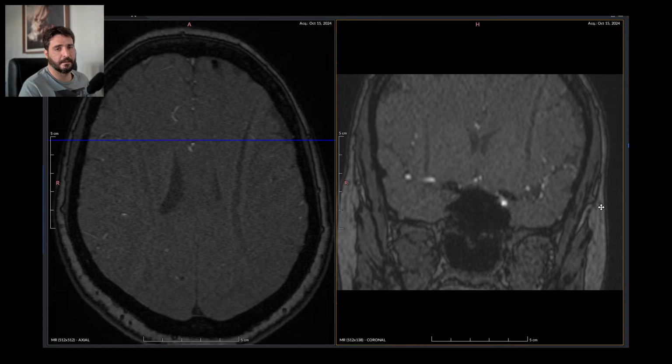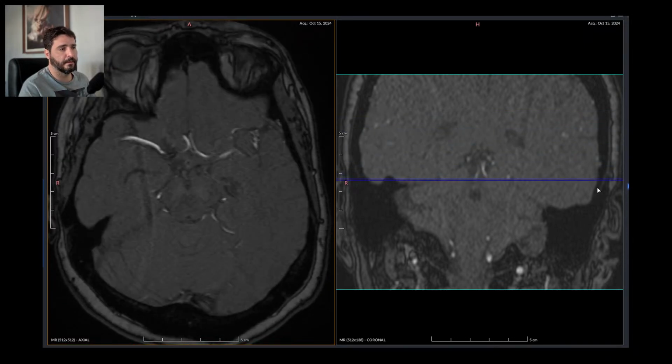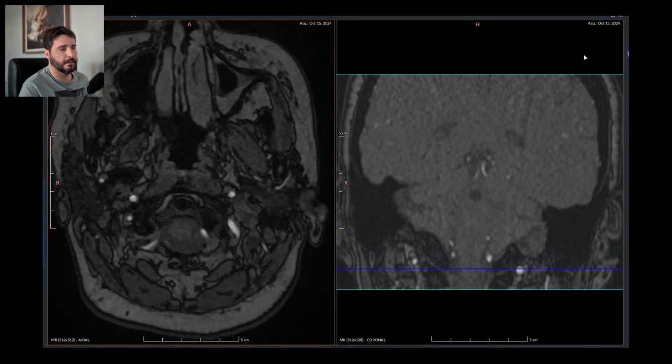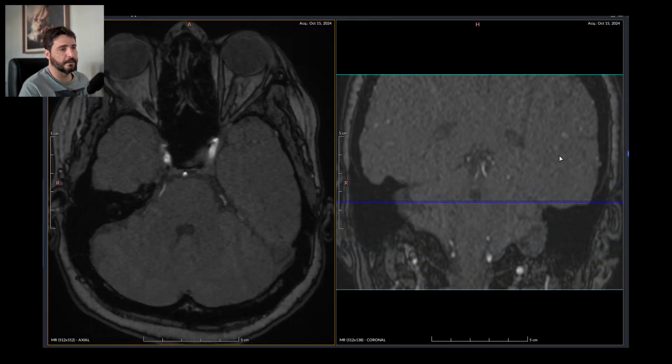Why not? It's just every day like that. He didn't repeat it because clearly he can't do it. So why repeat it wrong once again if you can't set up the sequence properly? You just do it wrong once and send it for someone to report it.